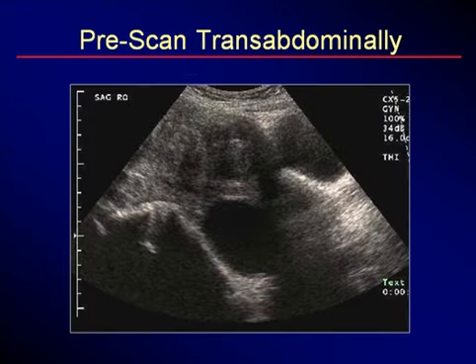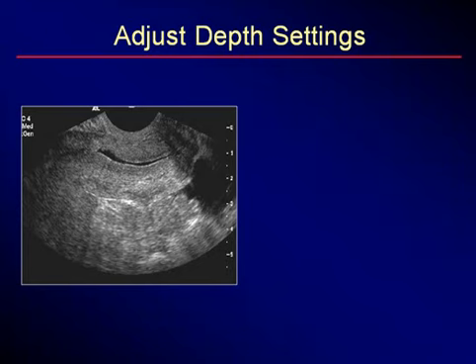And of course, if we had our transabdominal pre-scan, we would know that something's going on and there's a uterus and there's a mass, and we would have to evaluate everything. So this was going backwards, but if you were going in the proper sequence, transabdominal, then you go to maximal depth, then you change to shallow depth and high detail, you would have covered all bases.